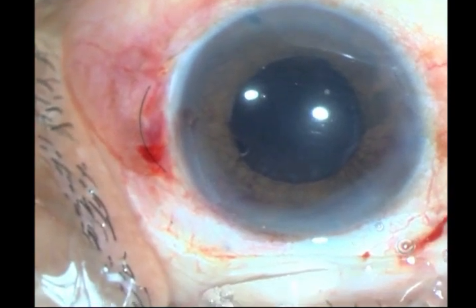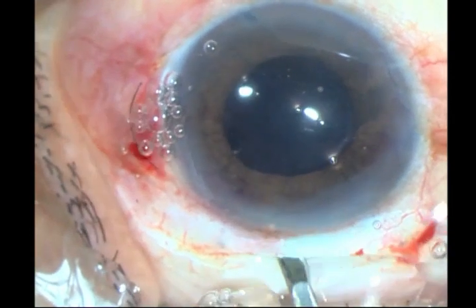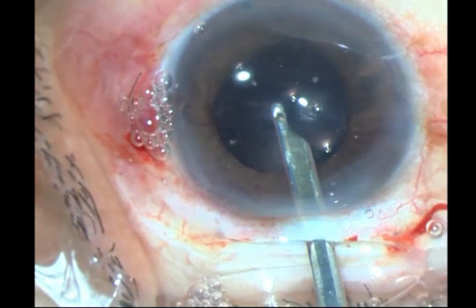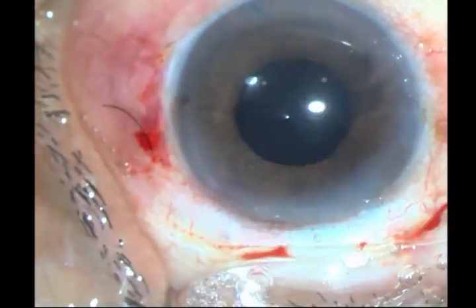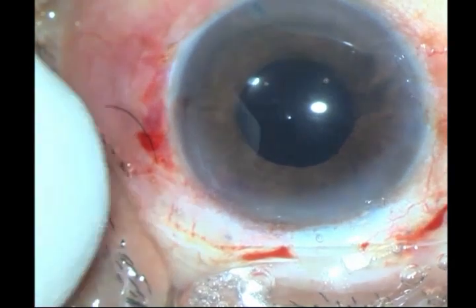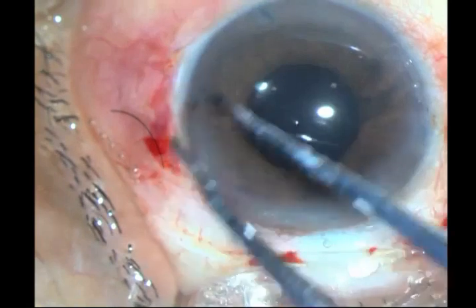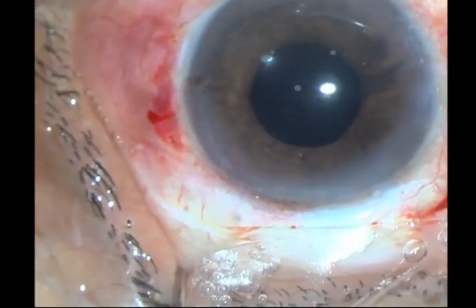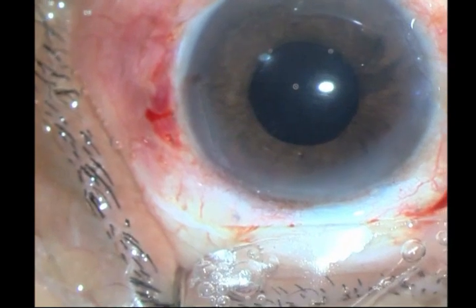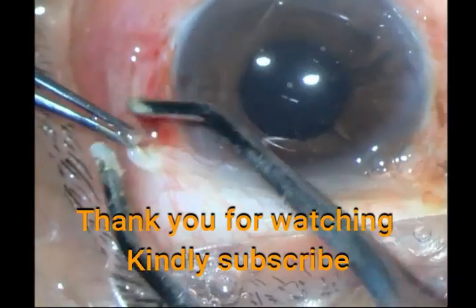I just then have to take out all this viscoelastic. This is a 5.2 lens, so you will see some optic if the pupil dilates a bit, but with that pupil size it is fine — it looks good. I conclude by putting some intracameral antibiotic and closing the incision with wet field cautery. Thank you very much for watching.